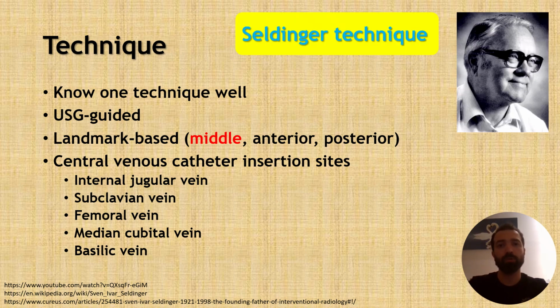We frequently use the Seldinger technique, presented to us in the 1950s by Ivar Seldinger, a Swedish radiologist. We commemorate and thank him here.